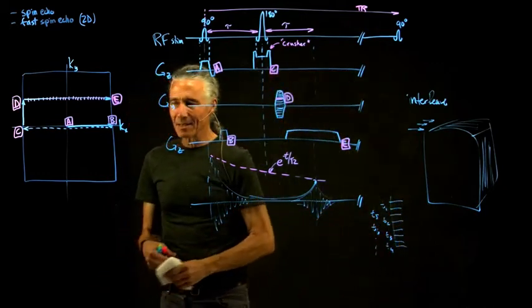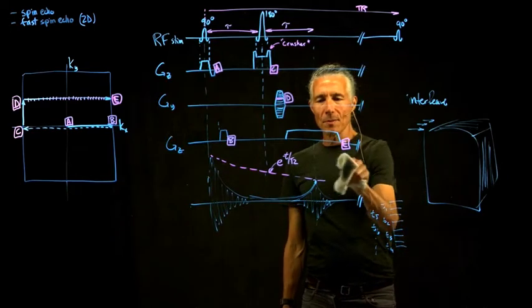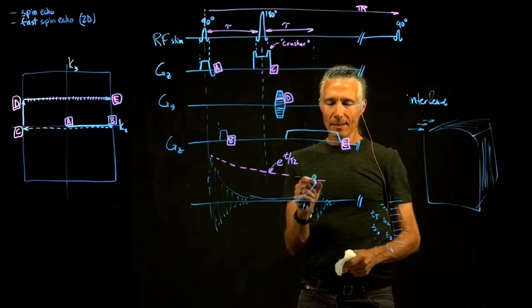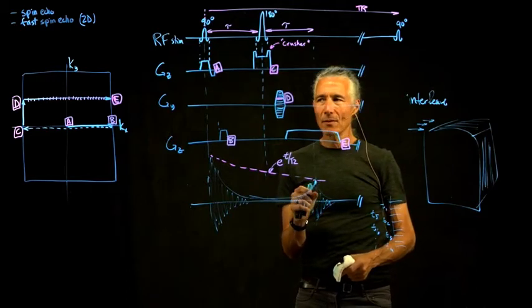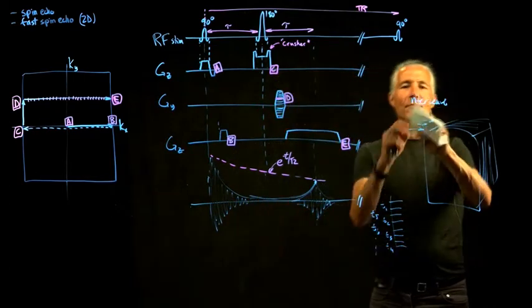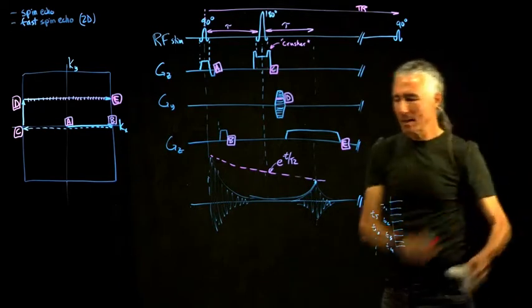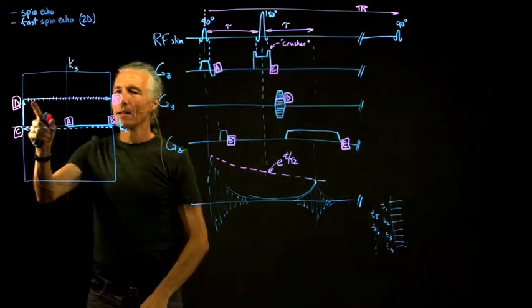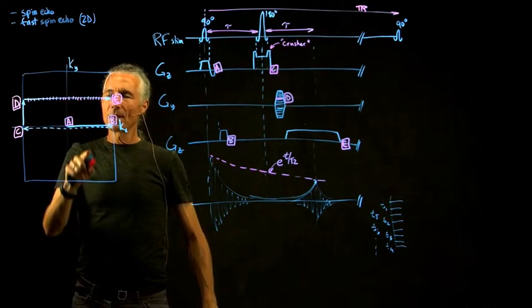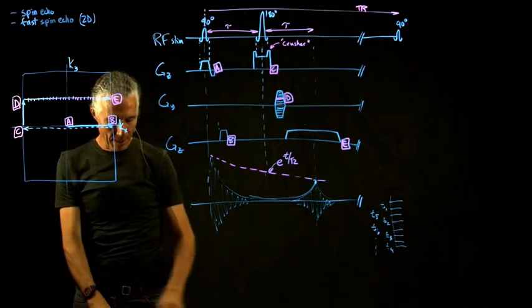So this is the classic SpinEcho. Now, what's the problem with it? Well, even with relatively thick slices, like 6 millimeter slices, it would take something like 40 minutes to collect one of these scans. And that's what they used to do back in the day. But the problem is, you're essentially collecting just one K-space line at a time. You've got to fill all of K-space, and you've got to fill all the slices, and all that has to be done separately.